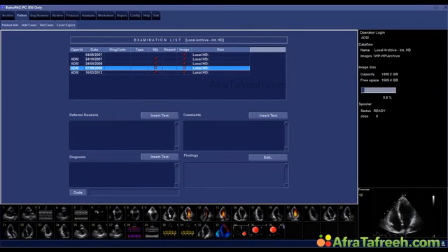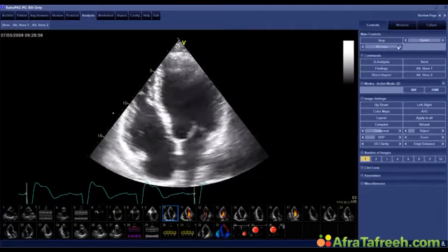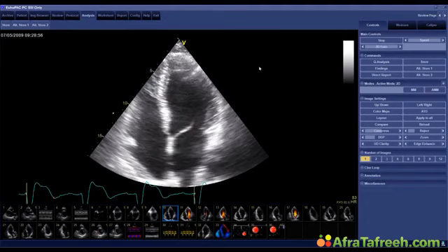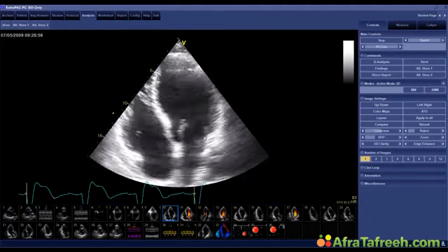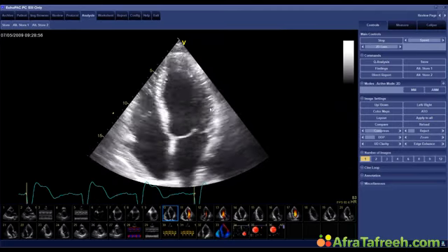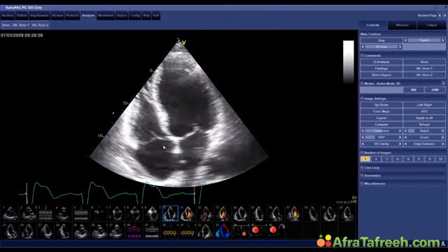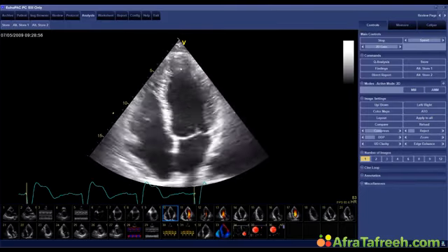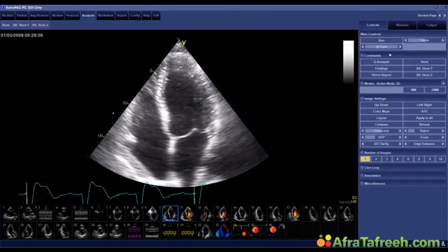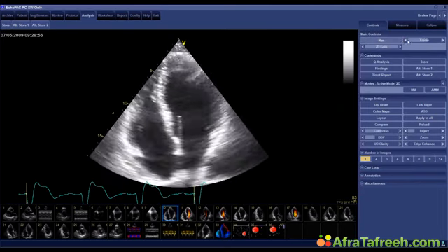But the story is still not over, because I want to show you the study we performed in 2009, 1 year later. Okay, so again, this is the image of the patient. You remember what we saw in the study 1 year before, where we saw no bundle branch block. Now again, he has bundle branch block. And we see that left ventricular function now is, again, rather poor. We see an abnormal septal motion. The left lateral wall seems to be doing okay. And let me just show you how large the left ventricle is. Just trying to find here the end diastolic frame.